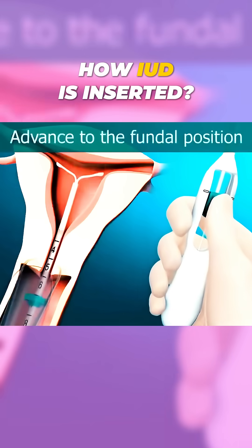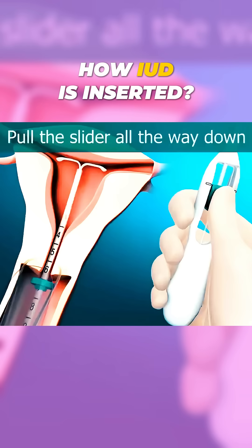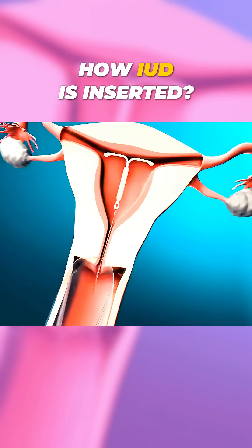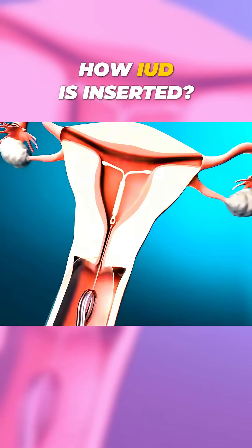Finally, the doctor trims the IUD threads so just a small length is visible. And that's it — the IUD is now in place and ready to provide protection. When it's time to remove the IUD, the doctor pulls on the threads with special tools, and a new IUD can be inserted if needed.